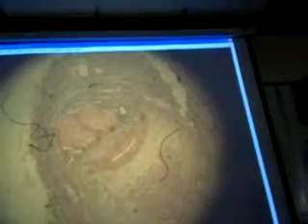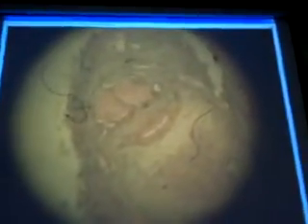Okay, so let me point this stuff out to you. Maybe you spotted the two corpora cavernosa. Corpus spongiosum, so what's that, lumen? Spongy urethra. Definitely put spongy urethra. It's through the penis. Let's go highlight it. So we can look at the transitional epithelium.